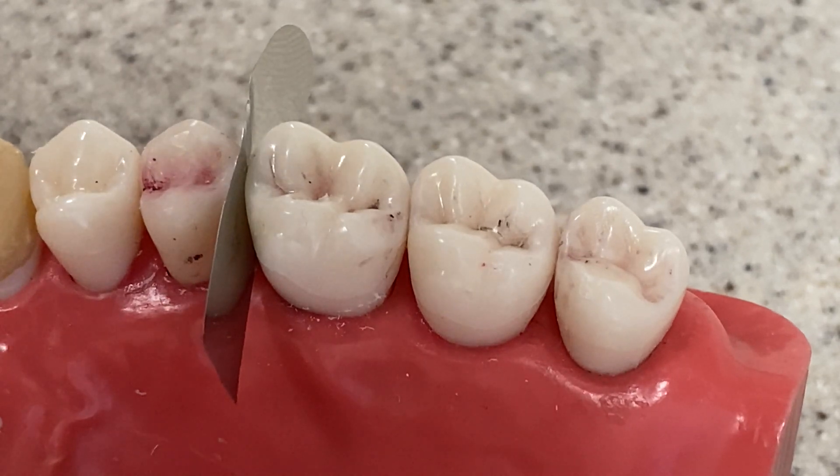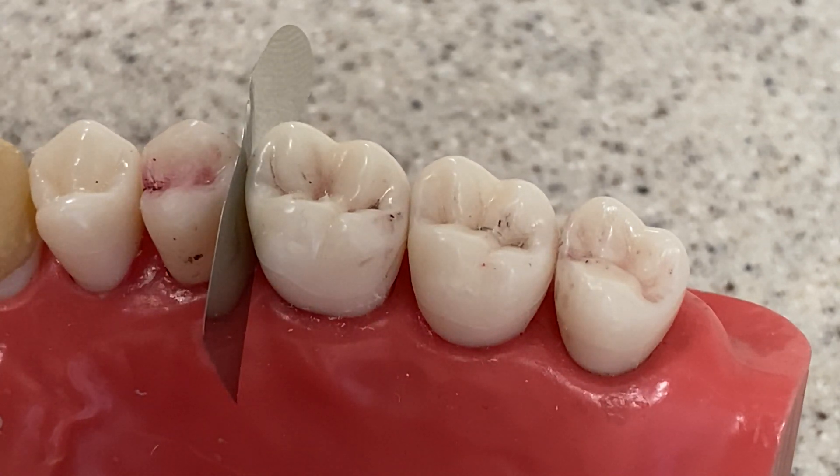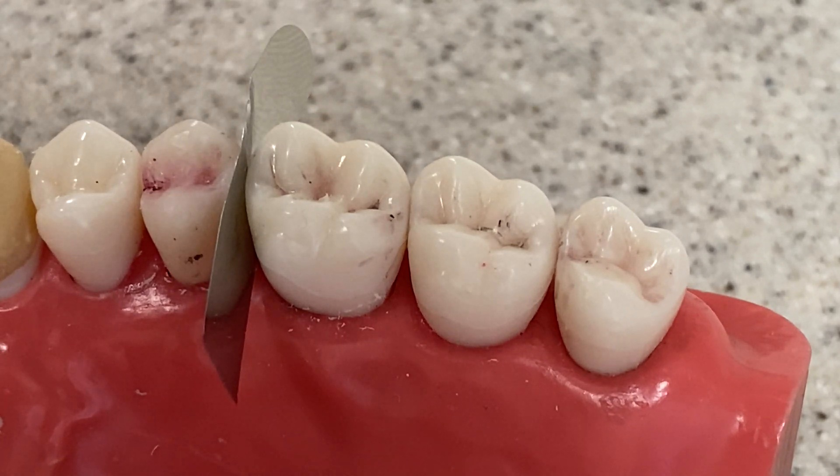You can go ahead and drill the MO, and you'll have a protective barrier. I highly recommend this if you have projects that you're going to be graded on — this is a great way to not damage the adjacent tooth. Or if you're taking a practical and you have to do an MO prep or an MOD or something like that. Of course, you can do the same thing to the distal, to number 15 — the same exact thing: put the wedge in, slide the cut matrix band in partway, remove the wedge, slide the rest of the way in, re-wedge, and you're good to go.